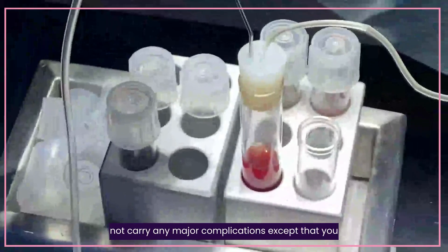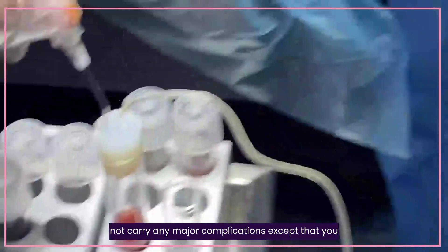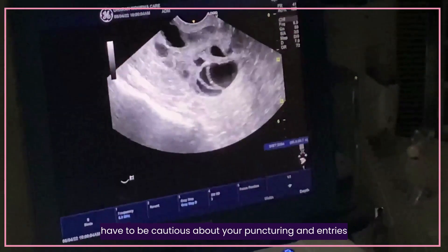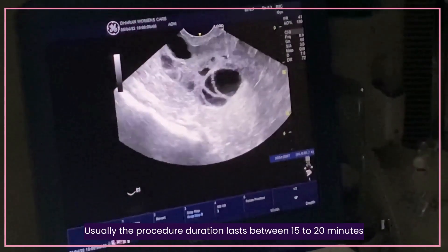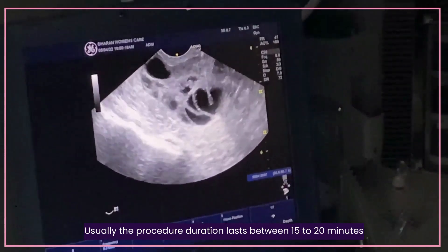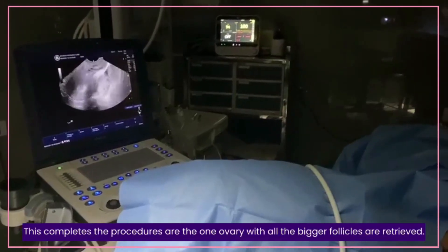The procedure does not carry any major complications, except that you have to be cautious about puncturing and entries. Usually the procedure duration lasts between 15 to 20 minutes. This completes the procedure.